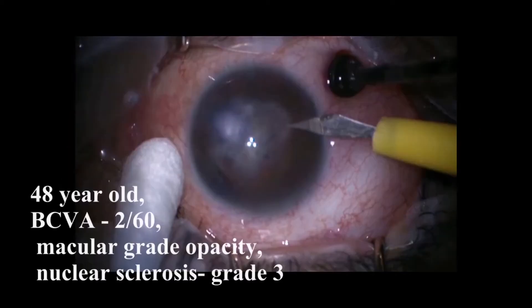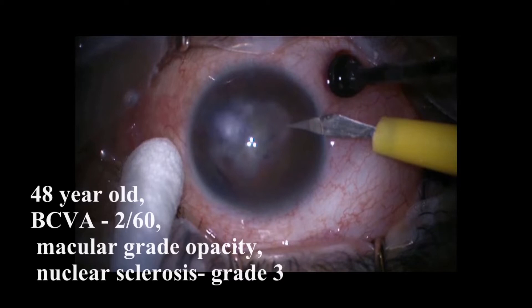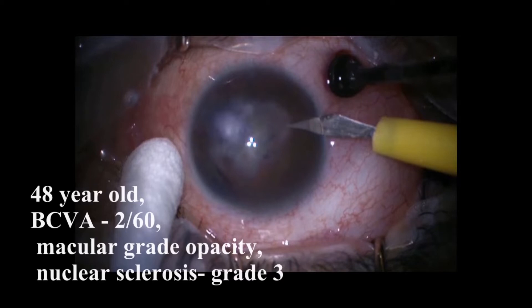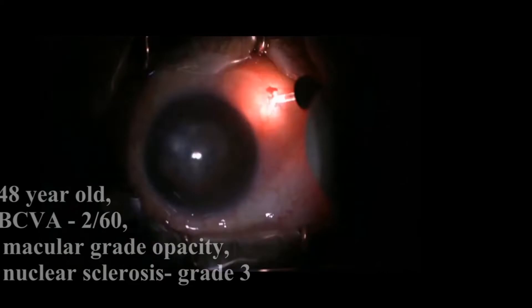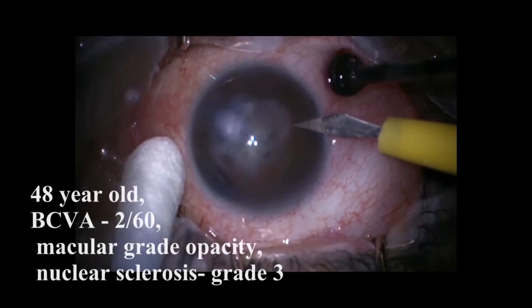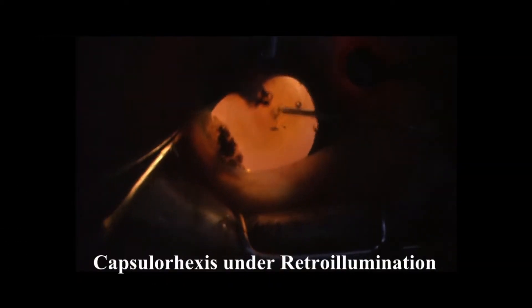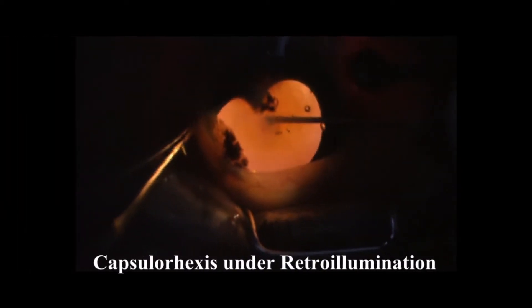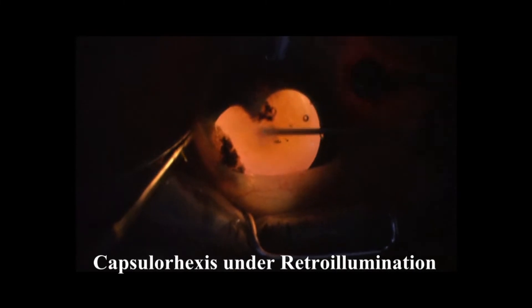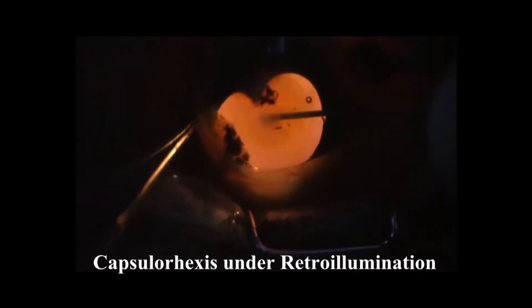Case one had a macular corneal opacity with grade 3 nuclear cataract. Chandelier illumination was introduced via a 25-gauge port in the infratemporal quadrant at 3.5 mm from the limbus. Capsulorrhexis was done with the aid of retroillumination, with microscope illumination turned off.